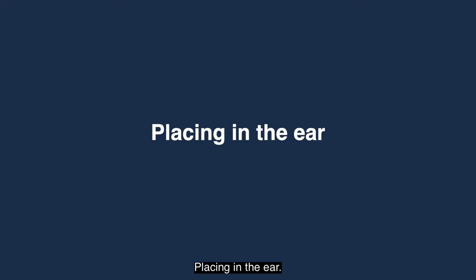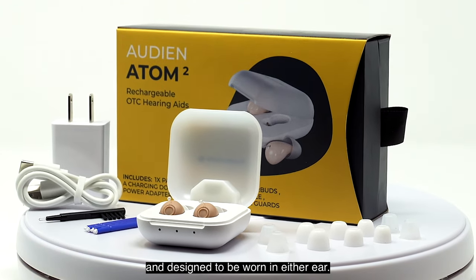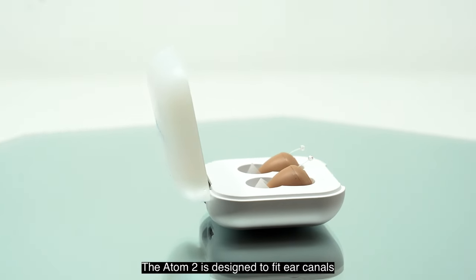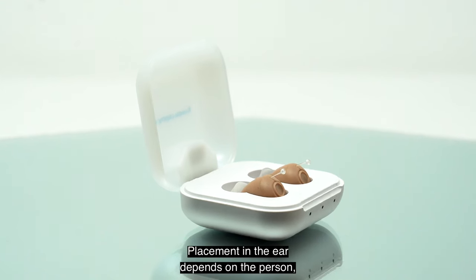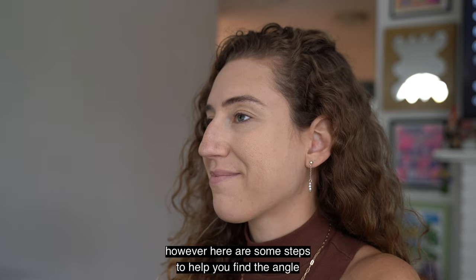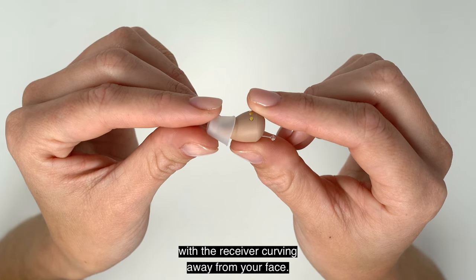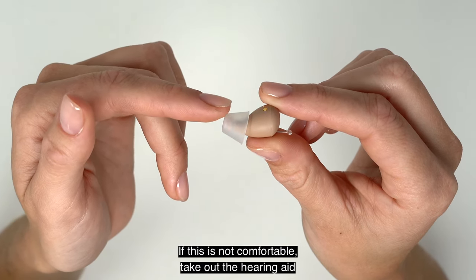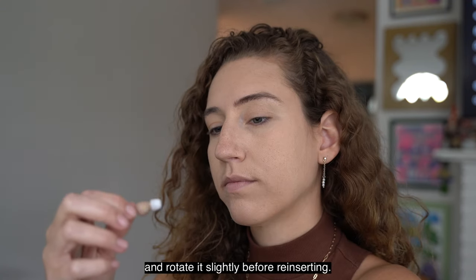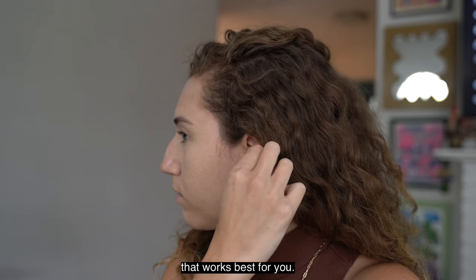The Audion Atom 2 is discreet and designed to be worn in either ear — it is not side-specific. The Atom 2 is designed to fit ear canals of all shapes and sizes. Start by inserting your hearing aid with the receiver curving away from your face. If this is not comfortable, take out the hearing aid and rotate it slightly before reinserting. Continue removing and rotating until you find the position that works best for you.